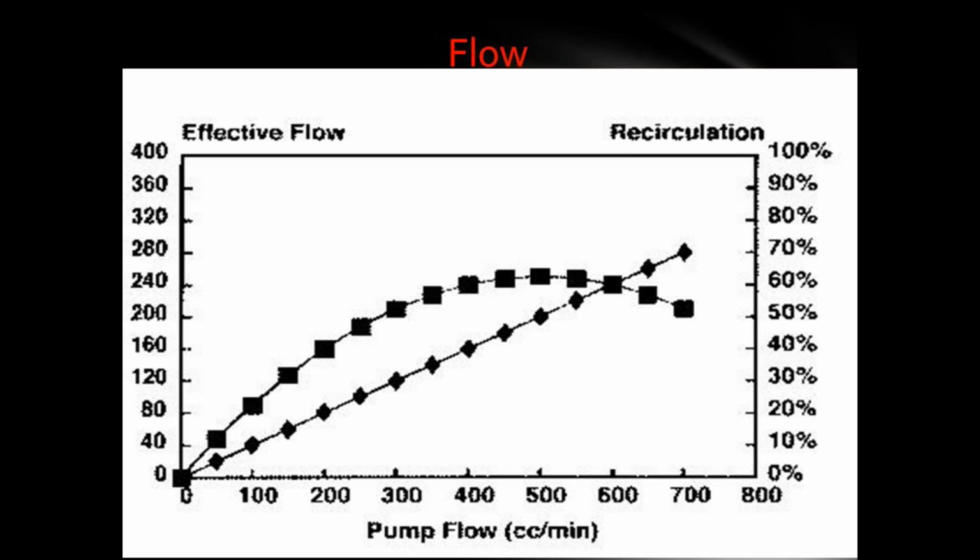And if saturation remains the same, that means you still don't require 5 liters of flow, you can manage with the 4.7 liters of flow. So that way you can keep on coming down on the flow till the time the saturation starts dropping. Understood? That is what we call defining the curve.